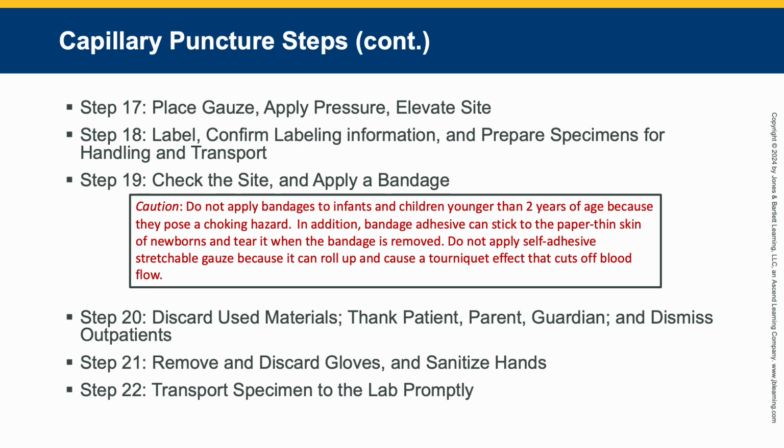Step 18, label your specimen, confirm the labeling information, prepare the specimen for handling and transport, and then take it back to the lab if that's you that takes it back. Step 19, check the site and apply the bandage. So right before you leave the patient, there is a thing you need to make sure of. Look at the caution. This is a test question.